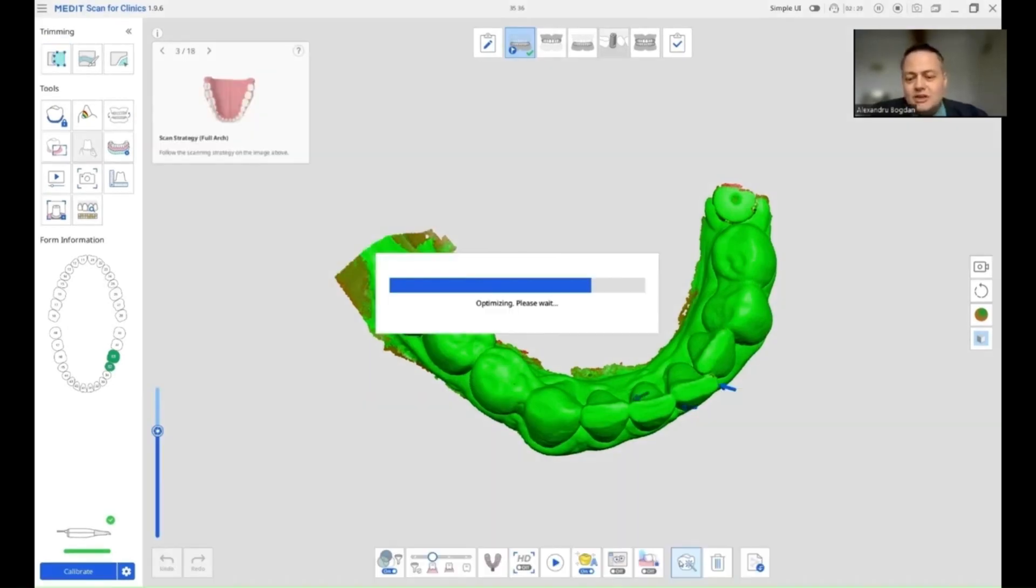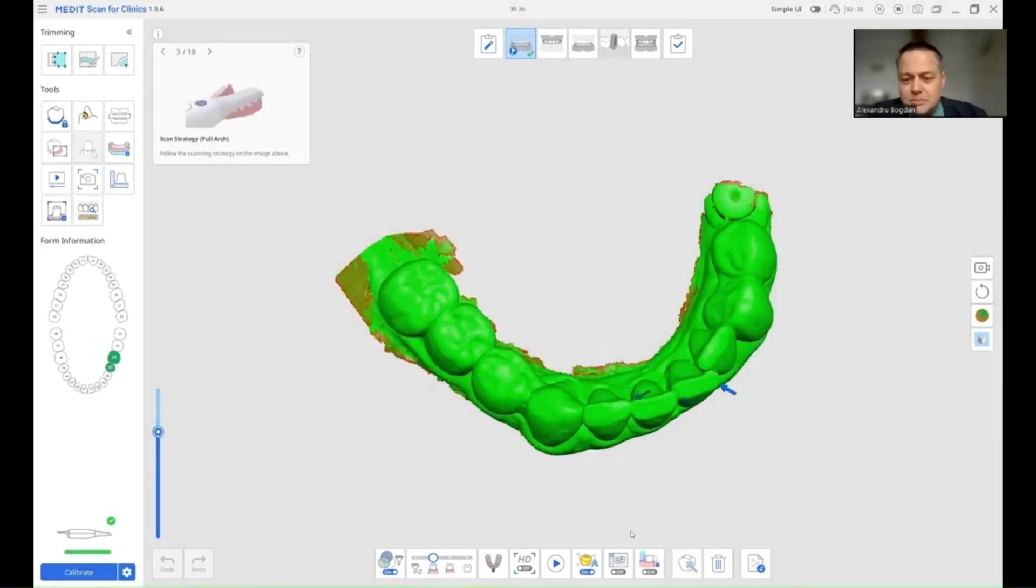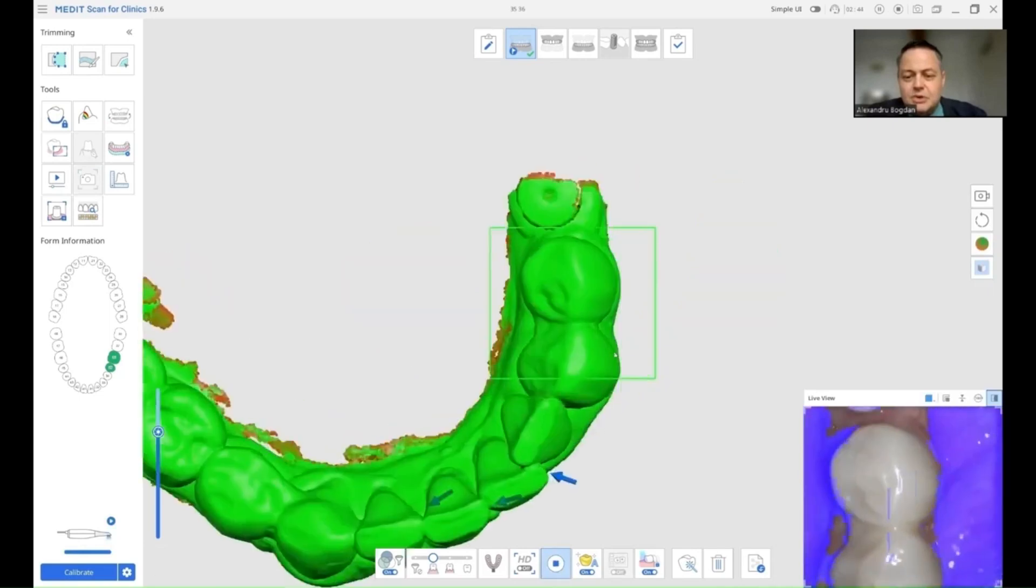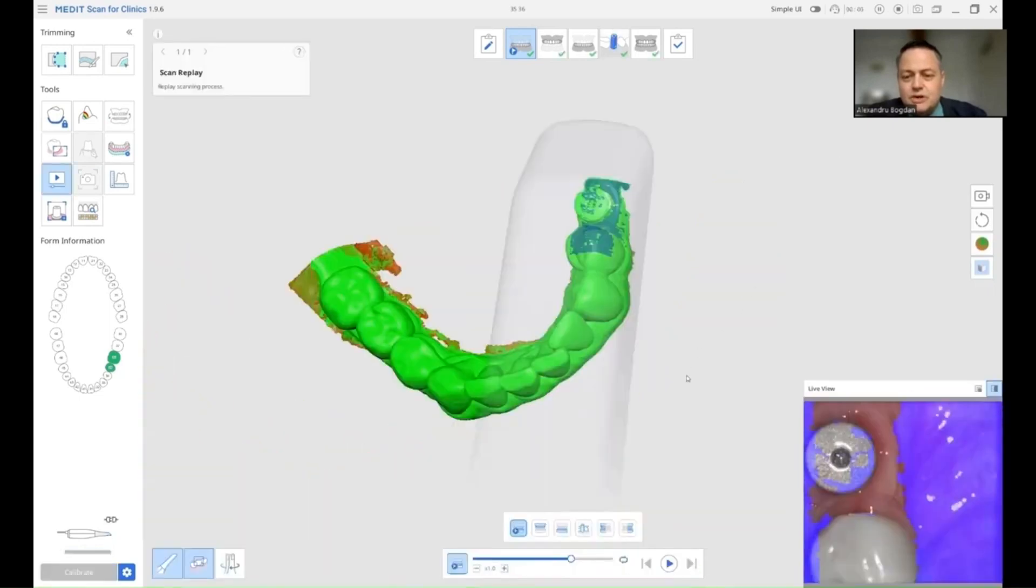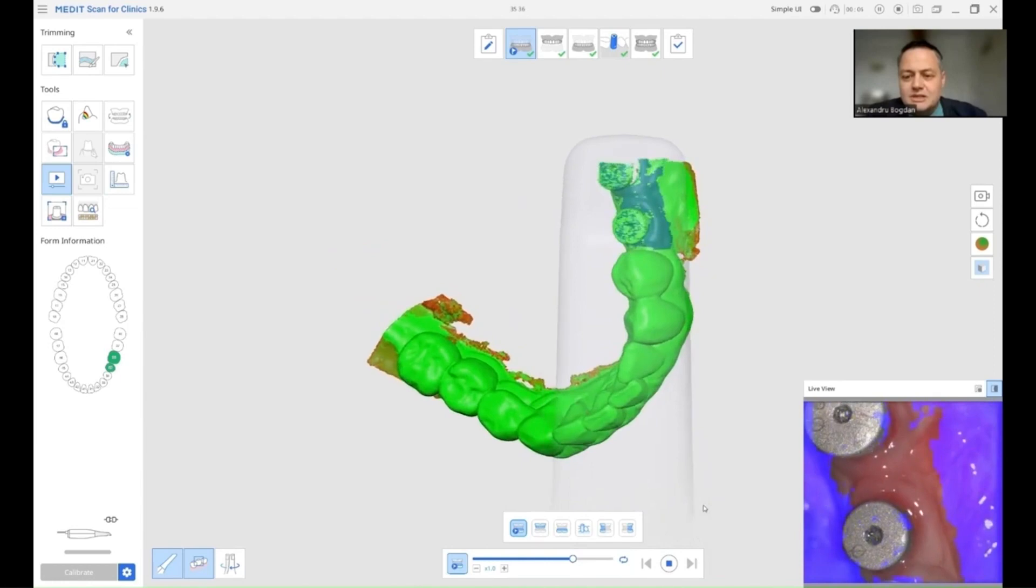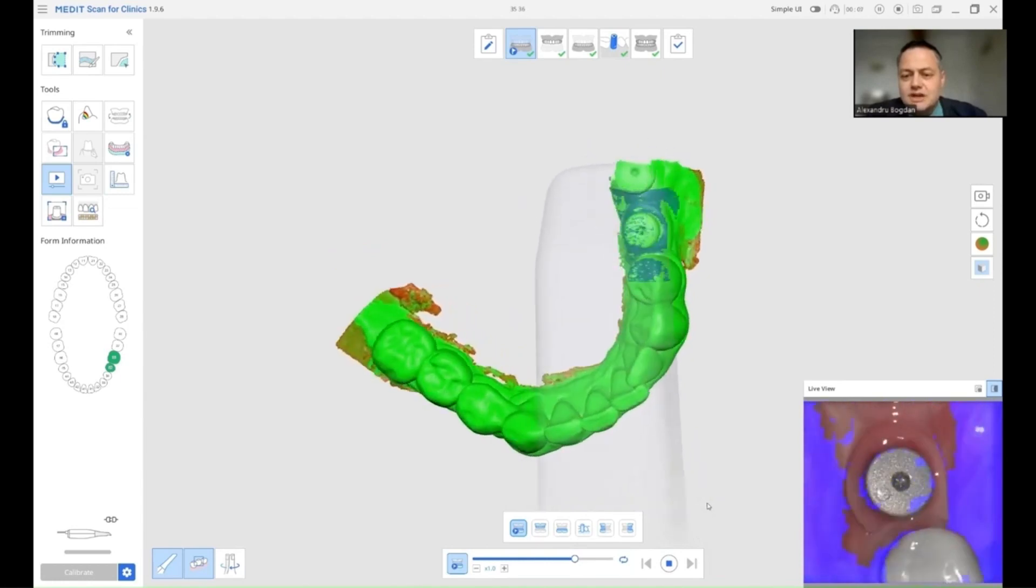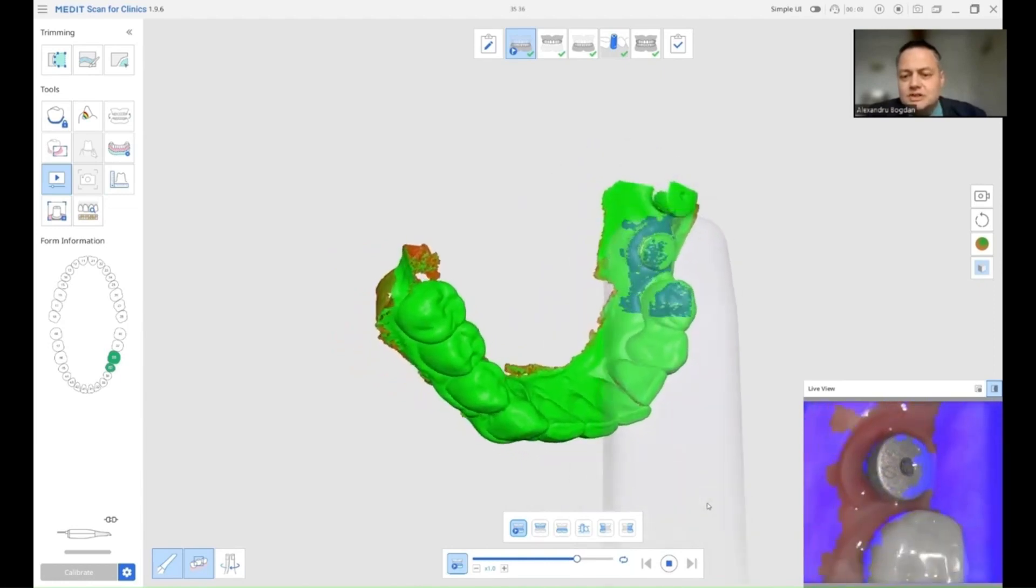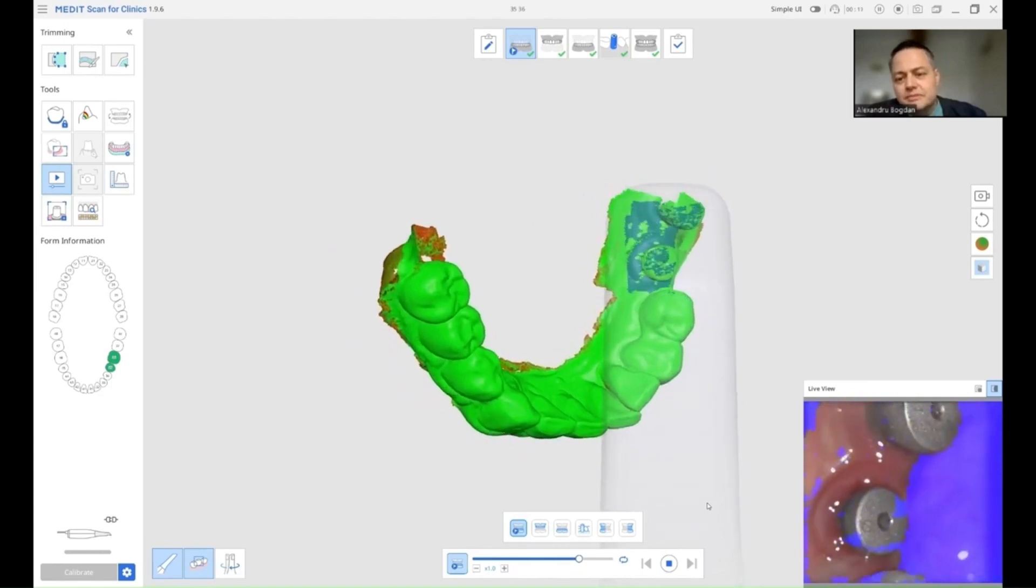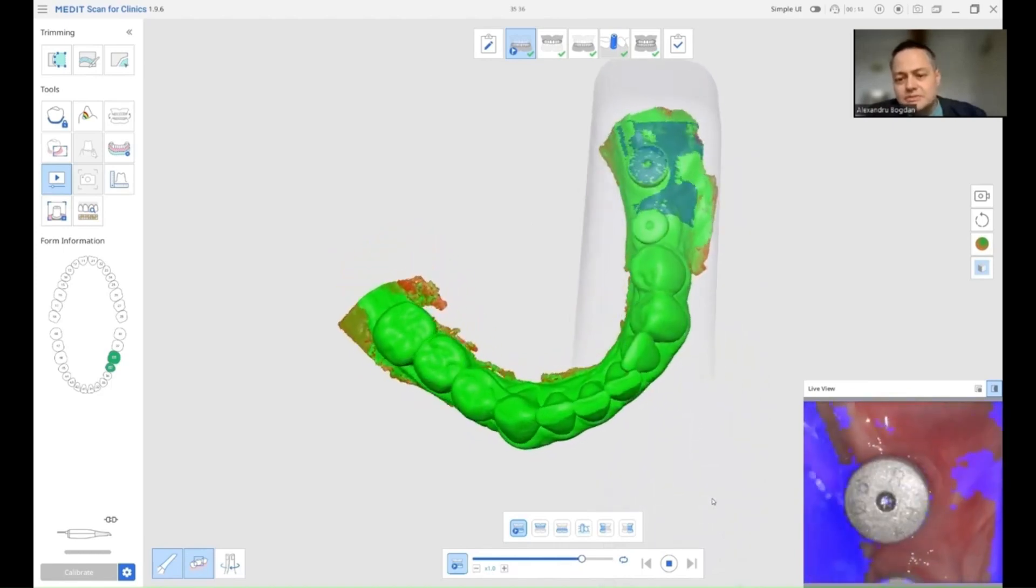Now is the time to activate slip checker, and I do this because healing abutments with the fixed gingiva around them are surfaces that don't have a lot of detail. I check slip checker and now I am going to image the healing abutments. Because they are sandblasted and the slip checker is on, it is very easy to take a good impression of the surfaces. I have all the data now.